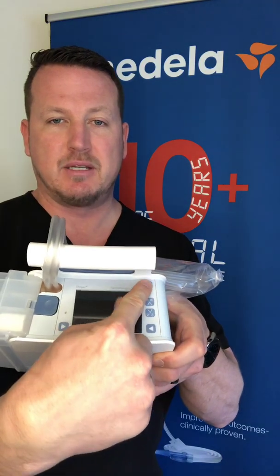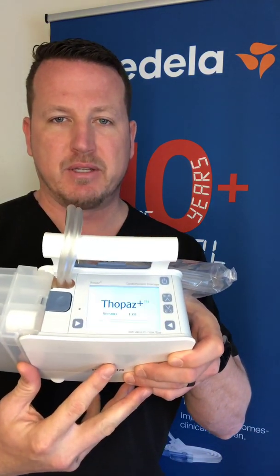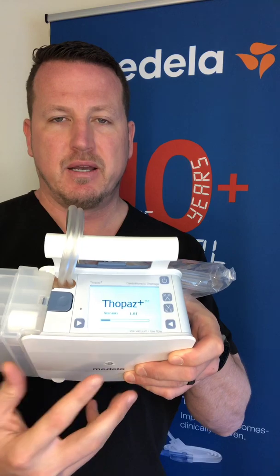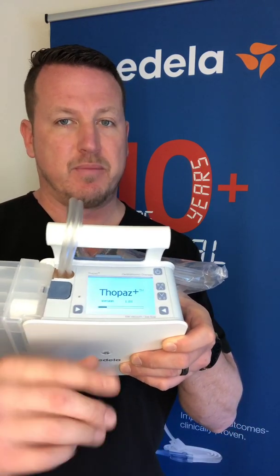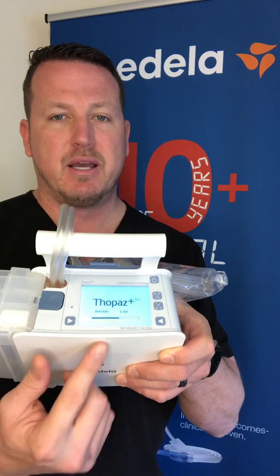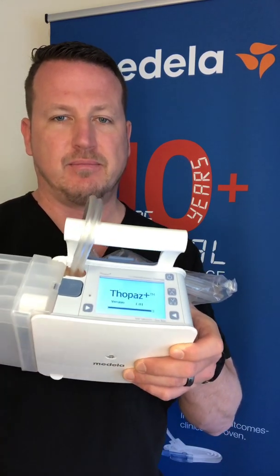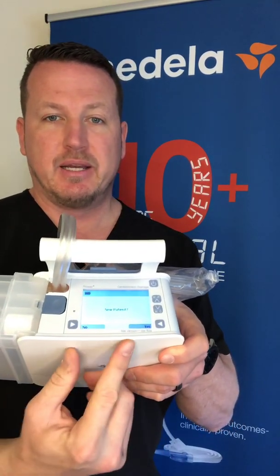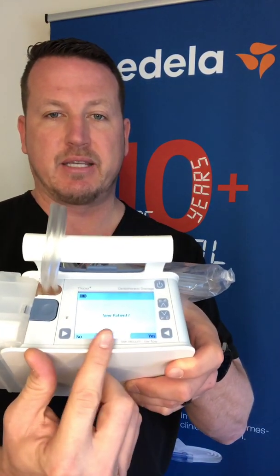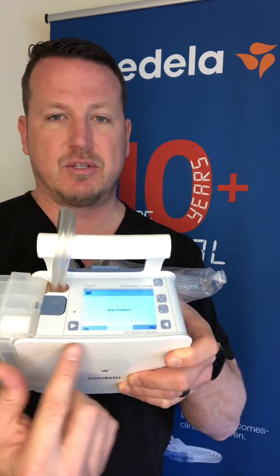To power on the Topaz Plus device simply press the top right button on the top of the device and it'll power on. This does not start therapy - this is simply powering on the device. It's going to go through an internal diagnostic check. Once the diagnostic check is complete it takes you to a screen asking if this is a new patient, yes or no.